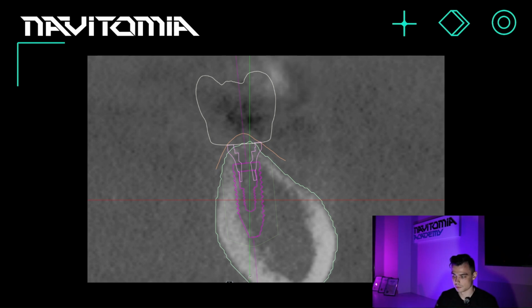As we mentioned in the first case, this is generally considered to be the most preferred and recommended way to position it. This placement of implants is called subcrestal. Not crystal as in the word crystal, but crest, because in Latin it refers to the cortical layer. So sub means under the cortical layer. That's why implants are most often positioned this way.